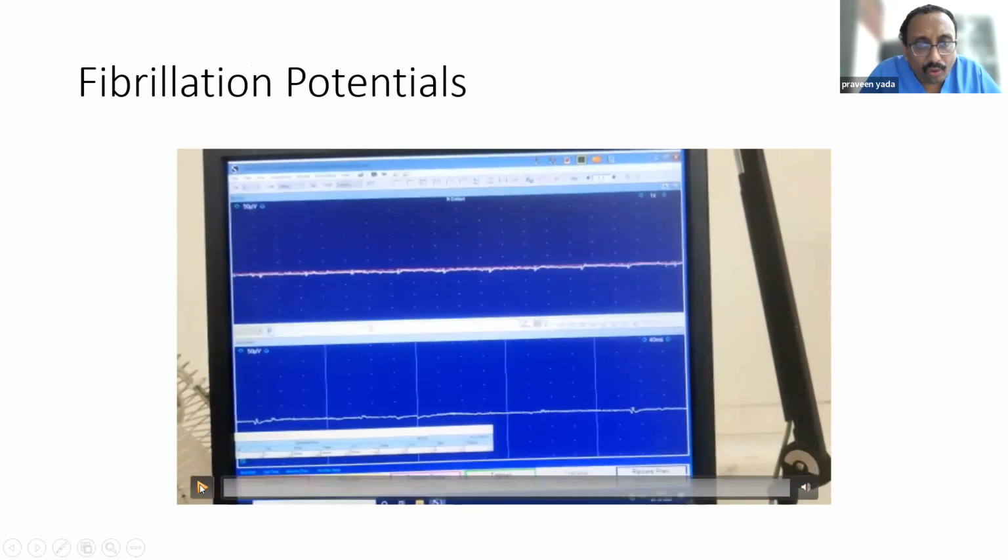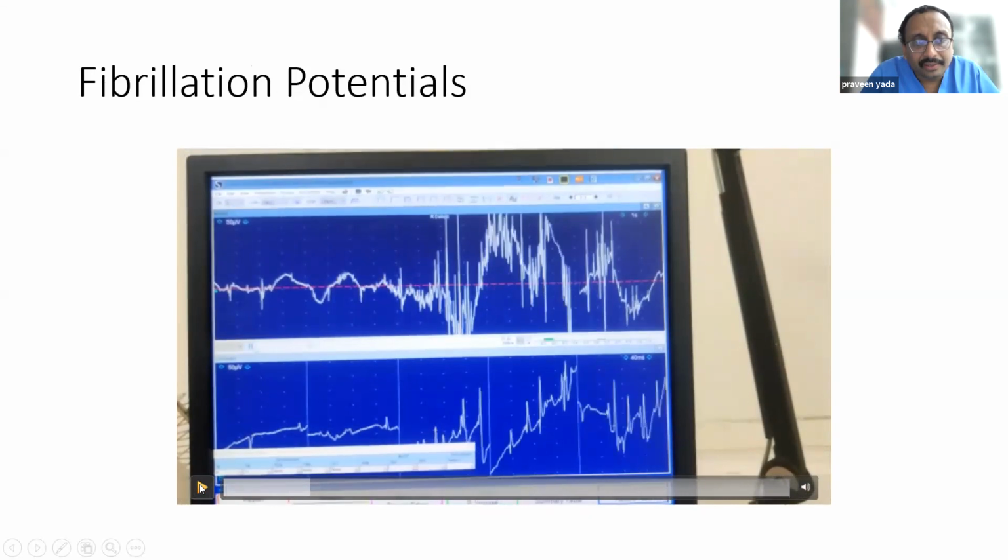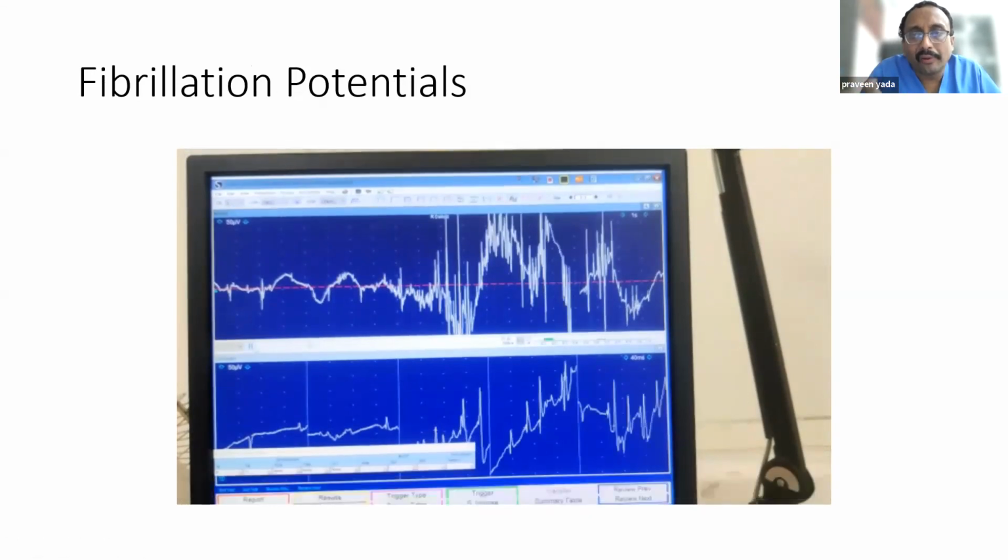The other feature I would like to say is that as you put the needle, you have a burst of activity that is called insertional activity. Therefore, after you put the needle, as there is a destruction of the nearby muscle, you will have a burst of activity that doesn't mean anything. But after waiting for 1 to 2 seconds, you should analyze it. I'll play it for you once more.